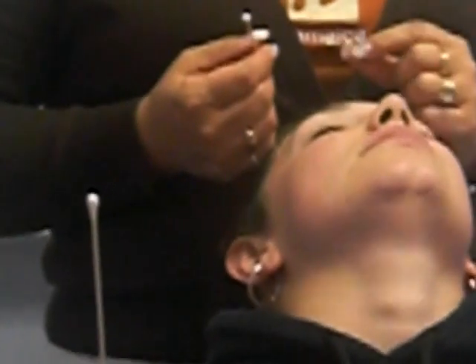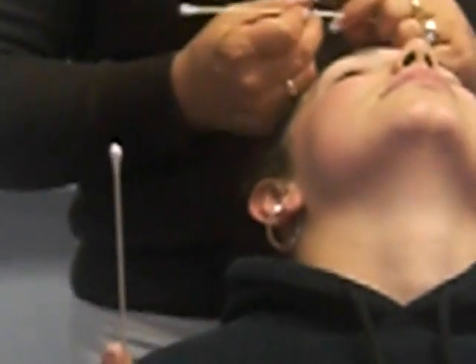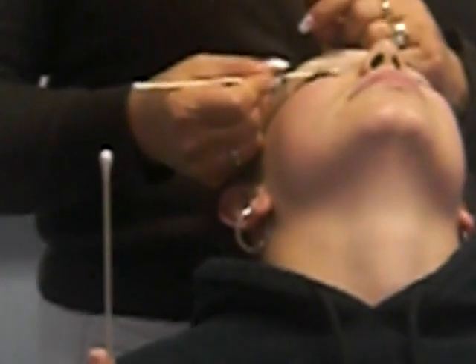So what we're going to do is pull on her eyelash and pull it towards her feet. That removes the suction — you'll hear it. It's just taking that suction off her eye. And then we're going to turn it over.